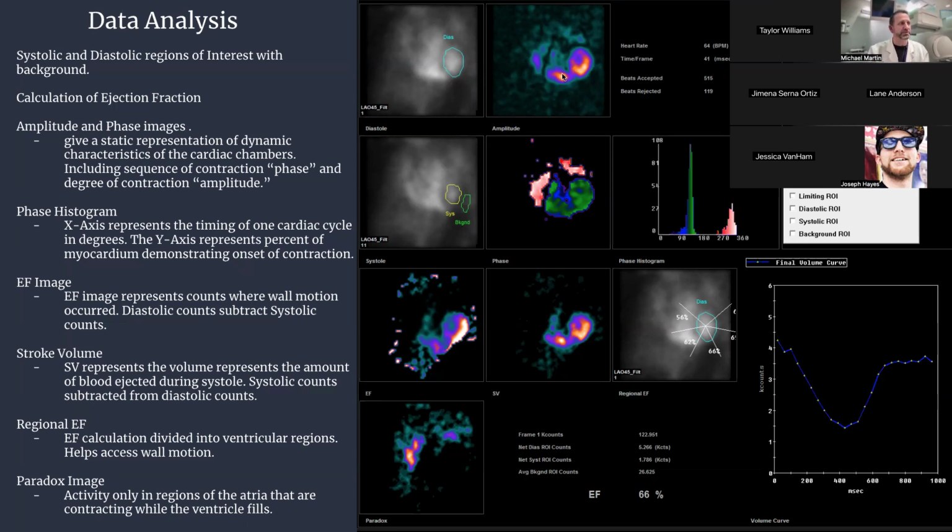Okay. That's the amplitude. Now the phase, and this is also the harder the contraction was also highlighted as well. The phase is similar in that the harder the contraction is a certain color, and excuse me, I said that wrong. I already told you amplitude was about hardness of contraction. This is the timing of contraction. And what you're seeing here is the ventricles, the left ventricle and the right ventricle, you can see filled up here. And they've represented it in this kind of green color. And then what they've done is they've represented the atrium that have filling here in a different color.